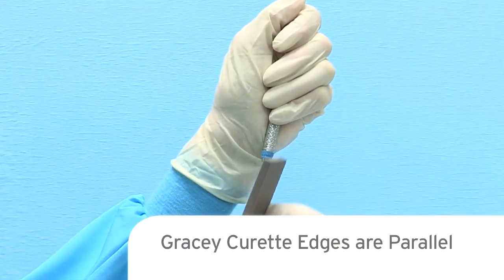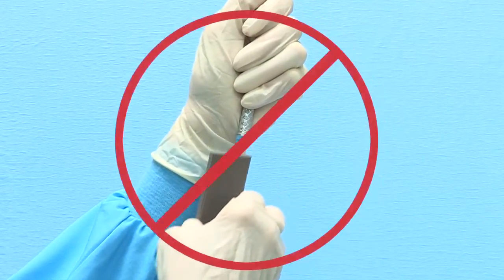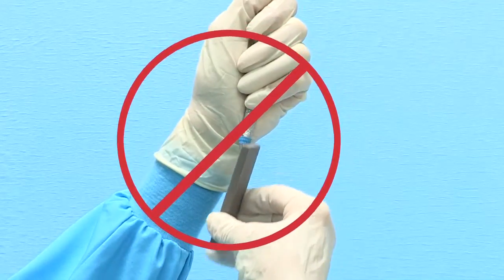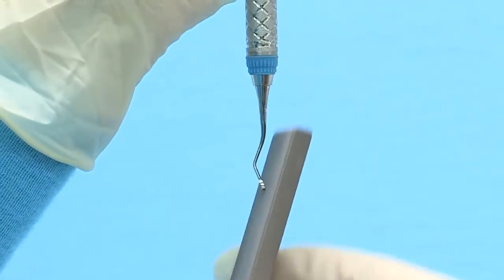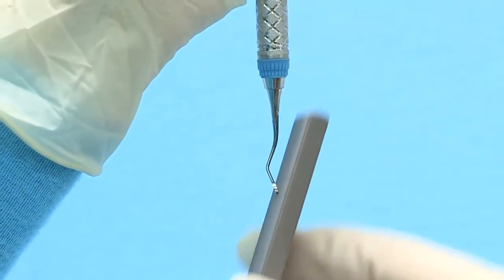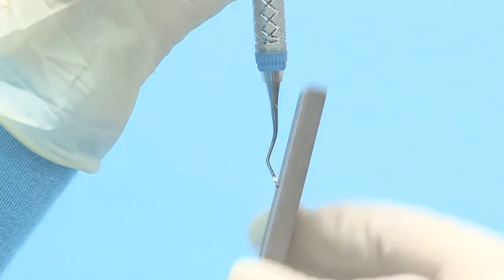It is important to remember that the blade of the Gracey curette is straight and not curved. When sharpening, do not rotate the stone as you move from the heel to the toe of the blade. Instead, sharpen the blade of the Gracey curette while proceeding in a straight line from heel to toe, as this will preserve the original blade design.